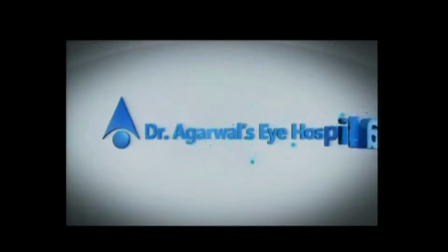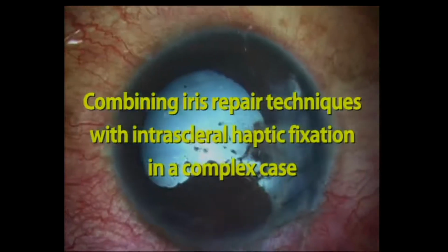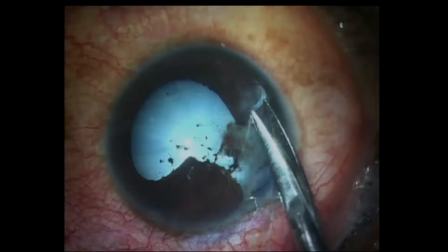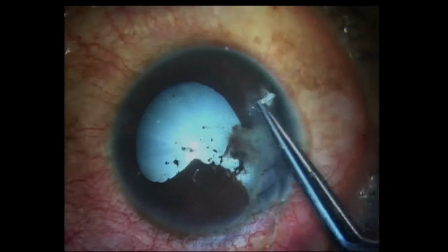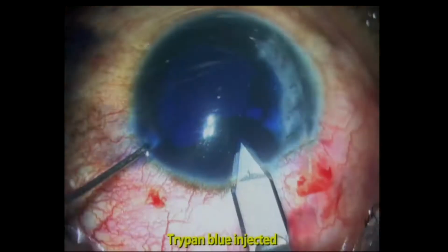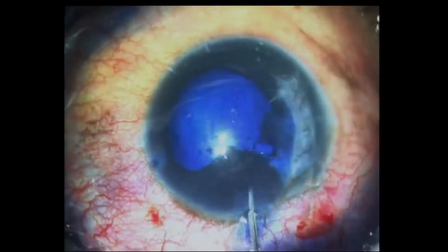Another case which I wanted to show you is a traumatic case where you have a small trauma on the side, but more importantly, it has also caused an iris root tear as well as an iris leaf, that is, a pupillary tear. So the iris is basically torn all the way.